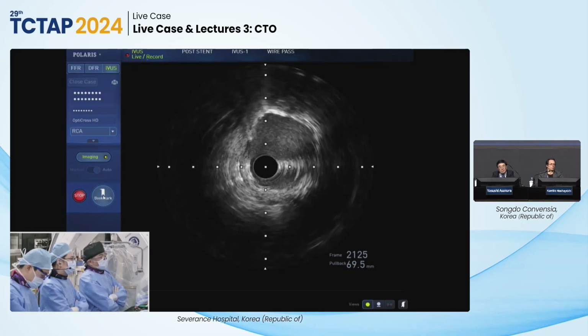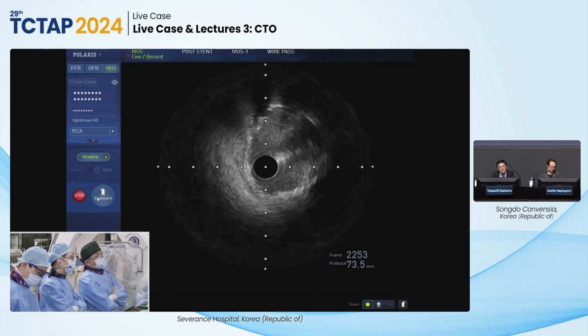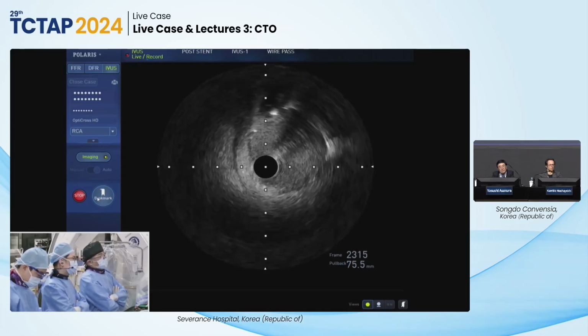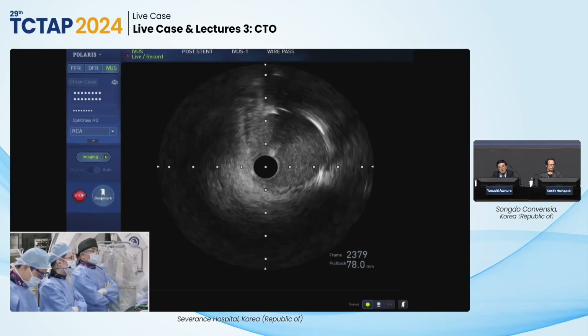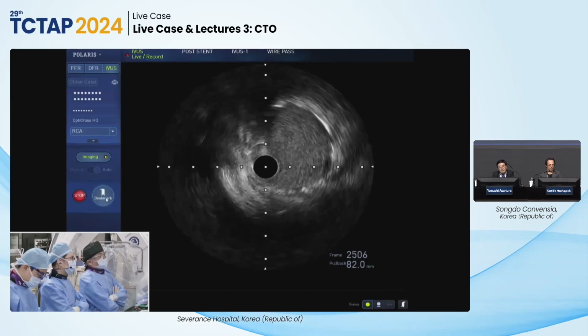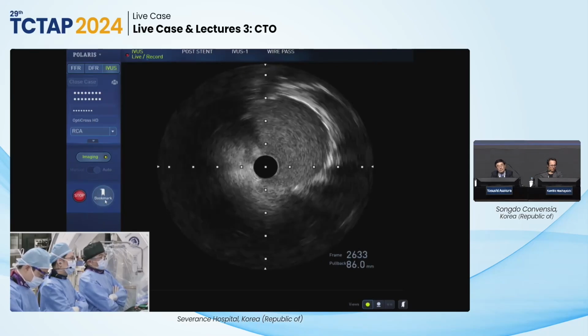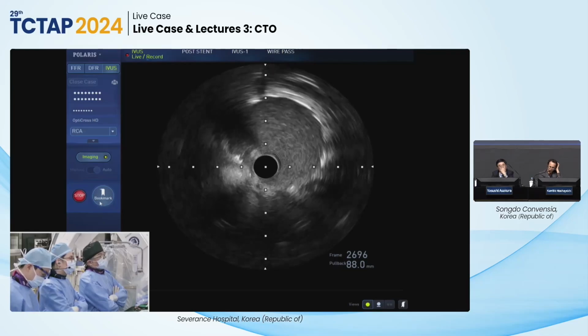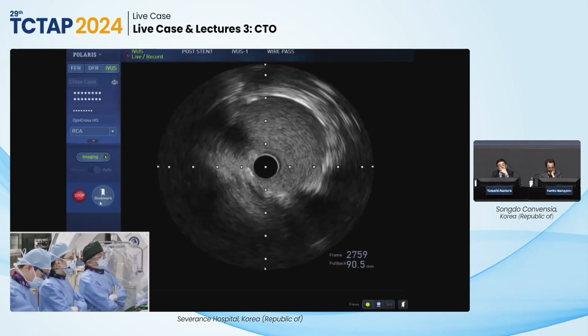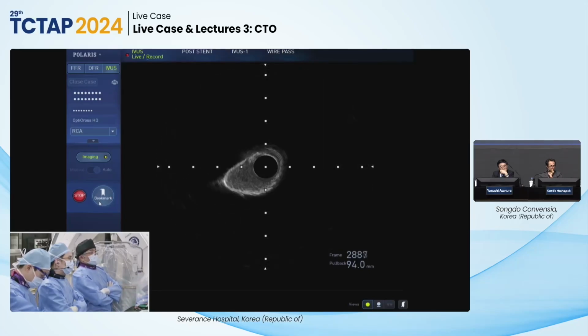We also have data that distal vessel expansion was noted, really in more than half of cases, especially with proximal CTO, where distal expansion occurs more frequently. So based on the follow-up angiograms, further treatment would sometimes be better.